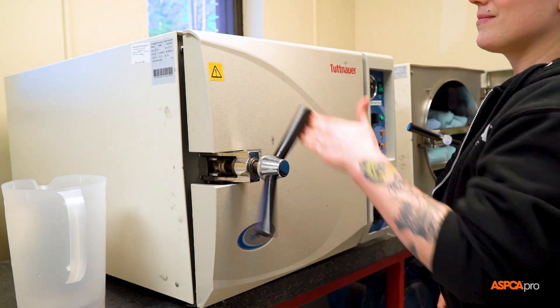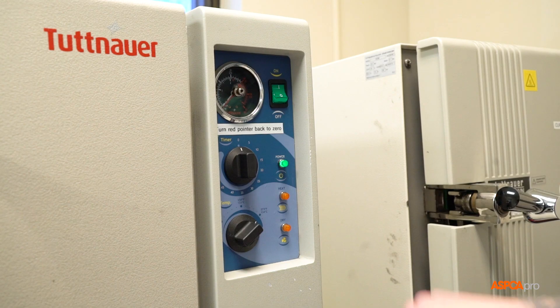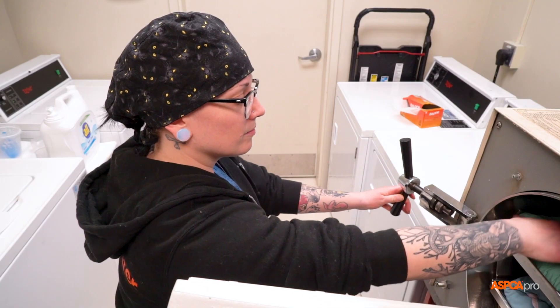Open the autoclave and set the timer to 15 minutes, the time needed to allow the packs to dry. Never touch the packs while they are wet or place them on tables.